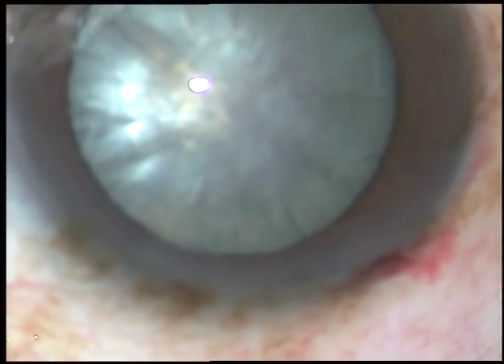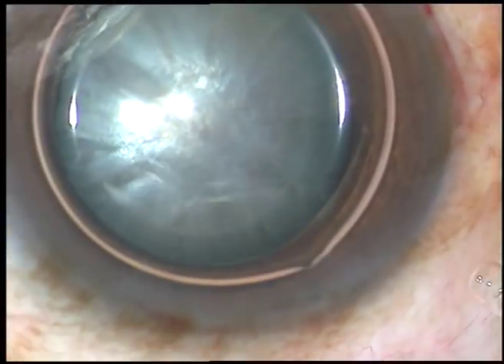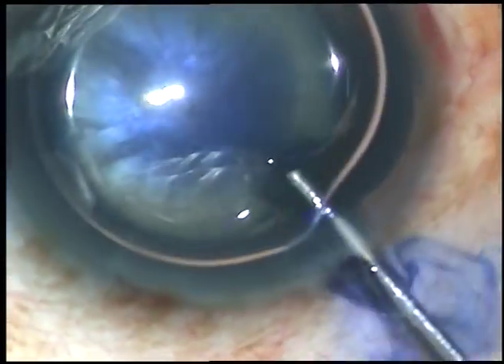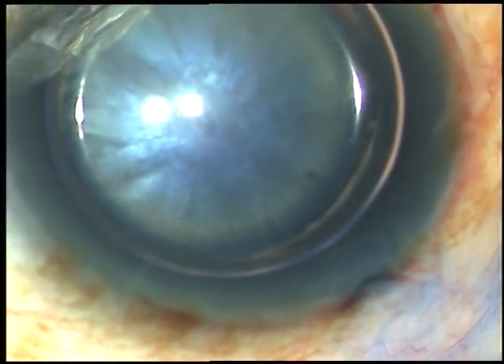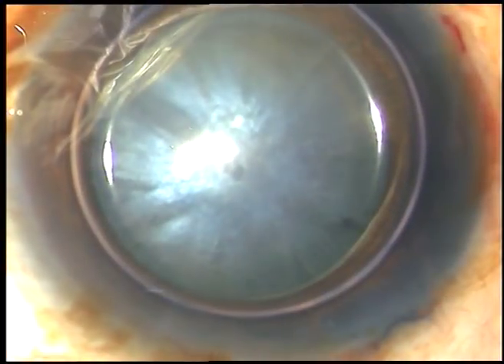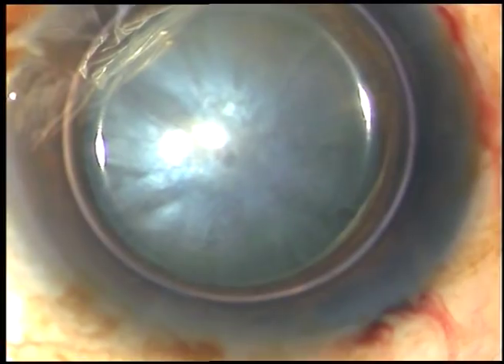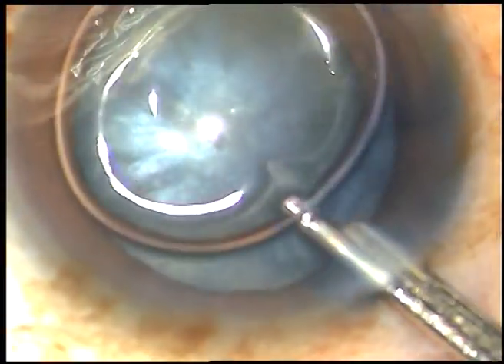Now I want to stain the anterior capsule with trypan blue dye. An air bubble has been injected. Now here goes the trypan blue dye. After five or six seconds, the dye is washed out. Now I wash the dye.